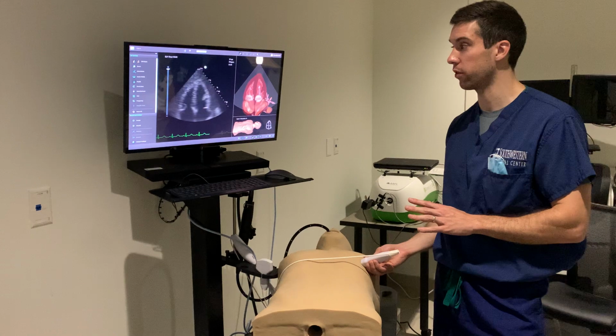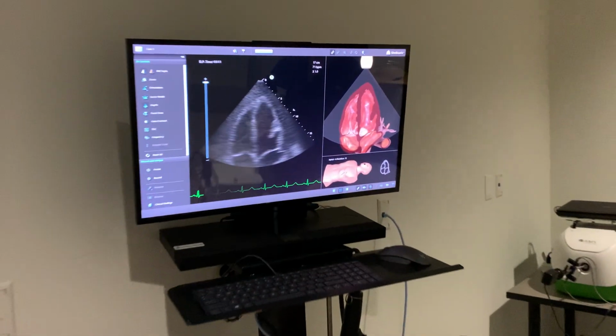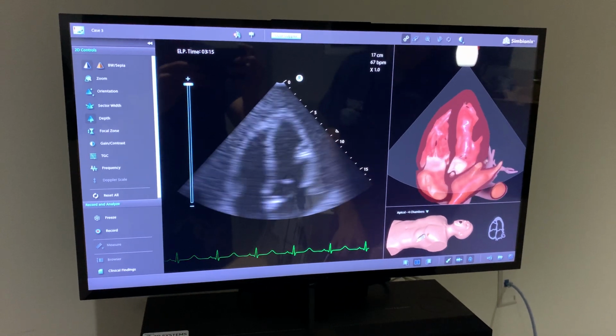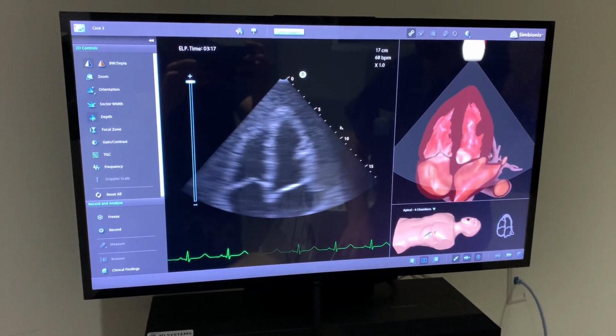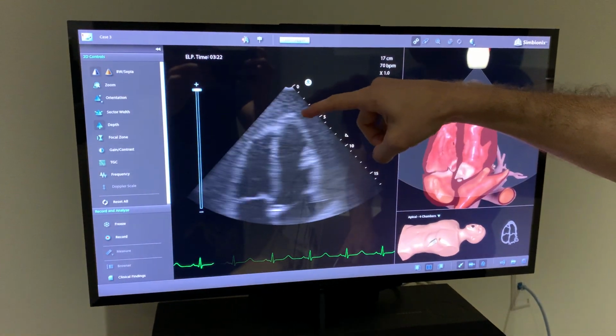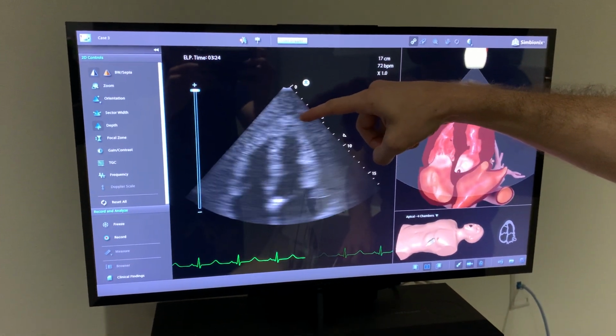You can see both ventricles. A couple points, because it can be a little bit confusing as far as which ventricle is which sometimes. I know you can use the indicator, but we sometimes forget. In a typical normal heart, the left ventricle should dominate the apex. So that is the ventricle that reaches the apex.